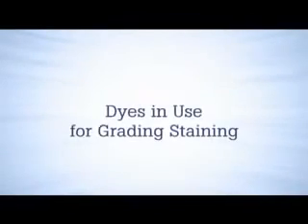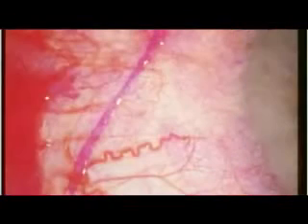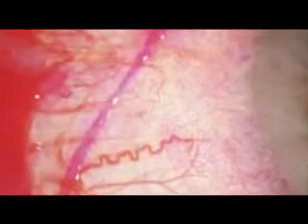Dyes in use for grading staining. Fluorescein. It was noted earlier that with the use of a yellow barrier filter to enhance fluorescence, fluorescein may be used to grade epithelial staining on both the cornea and the conjunctiva. Bengal rose. It is rare to use Bengal rose drops for staining because of the intense stinging they cause. However, Bengal rose impregnated strips are available and are used in the same way as lissamine green strips for the purpose of assessing conjunctival damage.